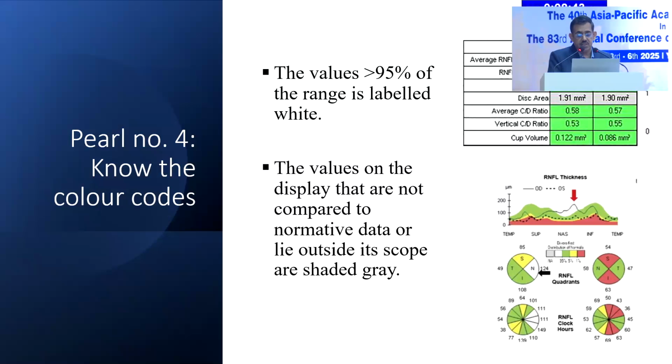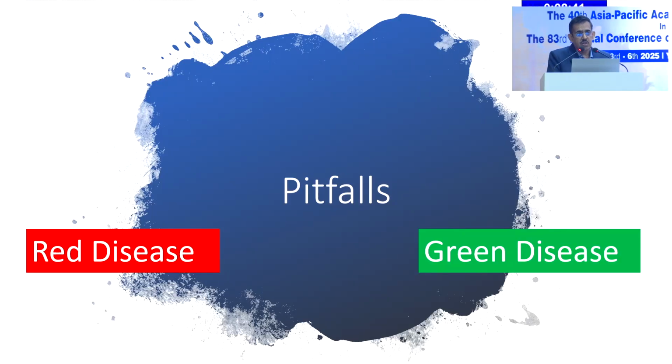This is important. In our over-enthusiasm for embracing OCT in diagnosis of glaucoma, we have come to a stage where there are terms like red disease and green disease. So we should avoid these pitfalls.